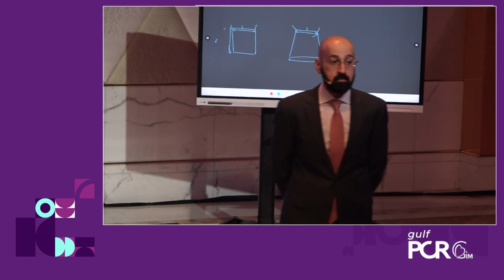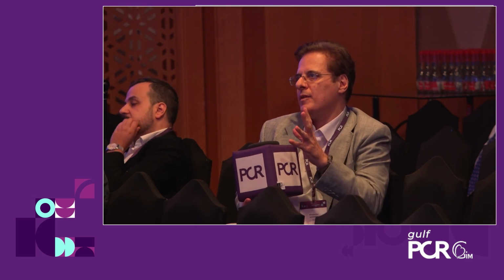Horizontal aorta as well. How about the small LVOT, smaller than the annulus? What's your experience or suggestion? Is it good or may it pop up the valve?